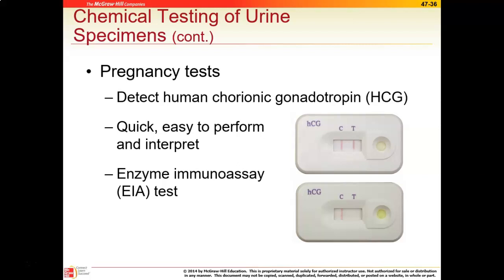Okay, most of these require 3 to 5 drops. It will vary depending on the brand that you put in that little chamber, and then they will either be developed or looked at and read in 4 to 5 minutes. And once again, it depends on the brand. Always check your brand and always make sure that you read your test at your time limit and then discard the test after you look. If you let that test sit around for 10, 15, 20 minutes, it's not valid, and sometimes you'll think you're seeing the test line show up, so it's important to make sure you read the test at their time limit and then record the finding and then dispose of them, okay? And don't let it sit around for 10, 15, 20 minutes.